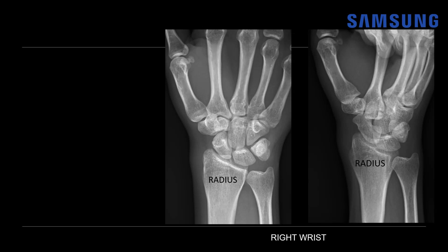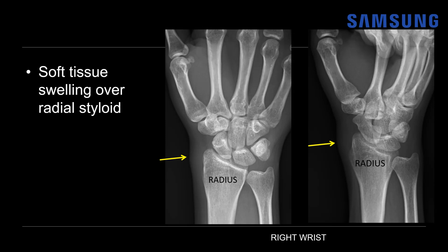Let's look at case one. This was a female patient in her 30s with pain and a palpable lump of the radial and slightly ventral aspect of her wrist, worsening with heavy use. Here we're looking at an X-ray of the right wrist — a frontal and an oblique view. There is some mild soft tissue swelling over the radial styloid, where the compartment one tendons extend. The APL inserts on the base of the first metacarpal, whereas the EPB continues to the base of the proximal phalanx of the thumb.